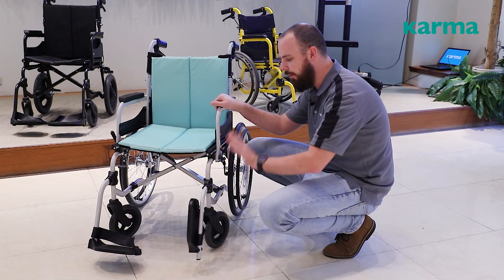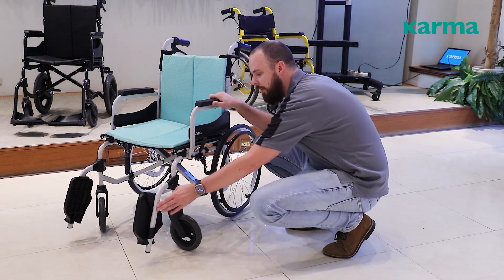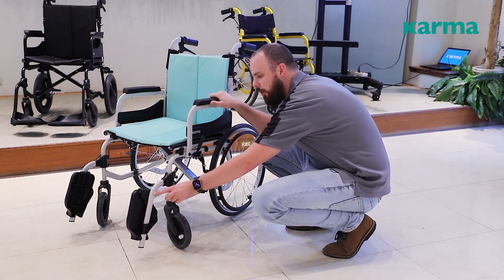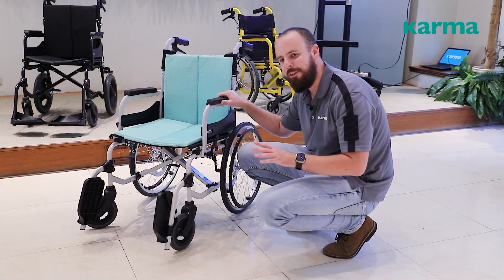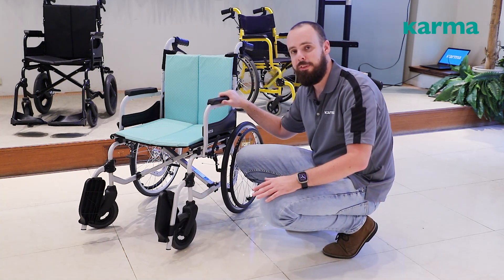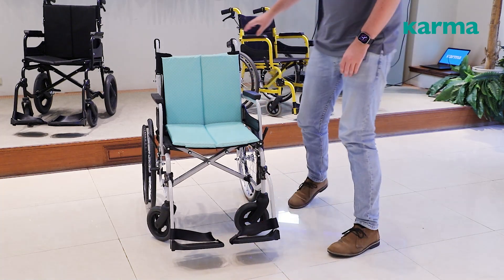We use that aircraft grade aluminum material all across the rest of the chair — very strong, very lightweight. I also want to show you our elliptical frame design, which is not typical for chairs in this segment. The tube is longer in the vertical axis rather than round. In addition to looking modern, sleek, and stylish, this also adds strength — for every amount of material used, this frame style is stronger than a traditional round tube.